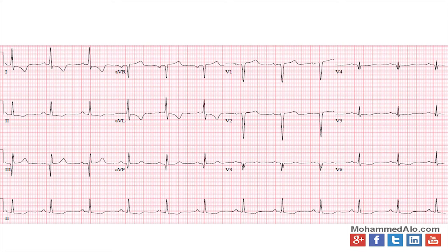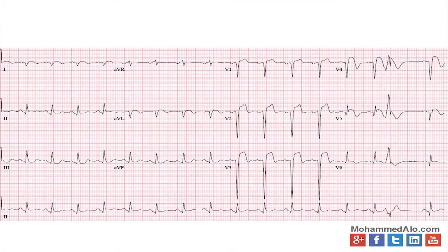Whenever you see an ST segment depress in one area, look for the reciprocal elevation, and you see 3 and AVF are elevated. Very important EKG to be careful with. Don't miss it. Here's your basic anterior MI again.